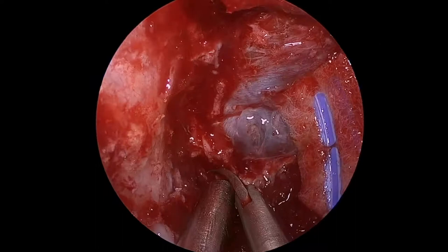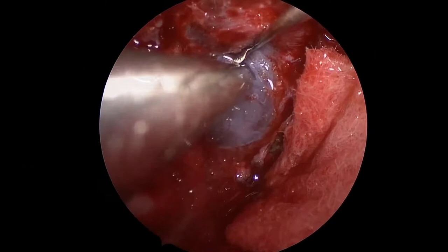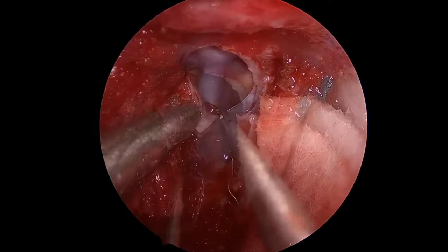I continue dissecting the dura that is thickened and potentially involved with tumor. I'm doing the similar operation on the patient's left side, pursuing the sixth nerve, but at the same time maximizing resection of the dura. That is the penetration of the tumor through the inner dura layer and through the arachnoid into the subarachnoid space. I'm doing a wide dural opening because all this dura is also potentially involved and needs to be transected.